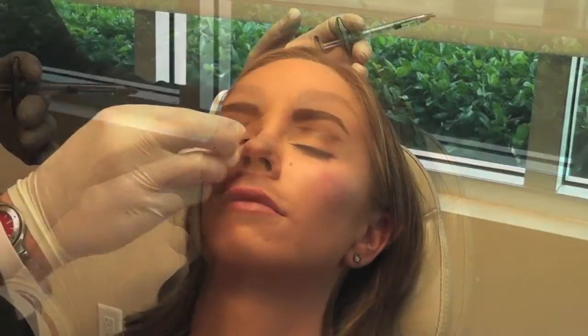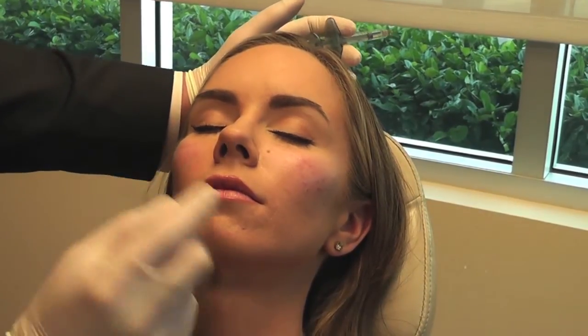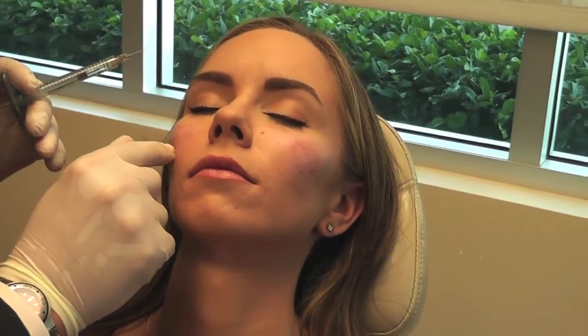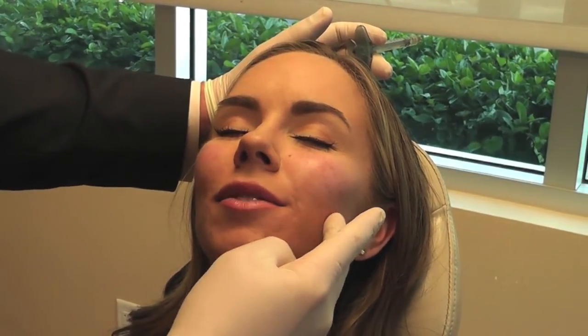Again, moving posteriorly toward the zygoma. Don't want to neglect that. And like on the left hand side, now we're going to concentrate on the submalar region in an effort to even things up, accentuate that malar mound. Don't forget that this patient smiles, so smile for me. Things need to look natural, both when a patient is relaxed and you can relax, and smiling.